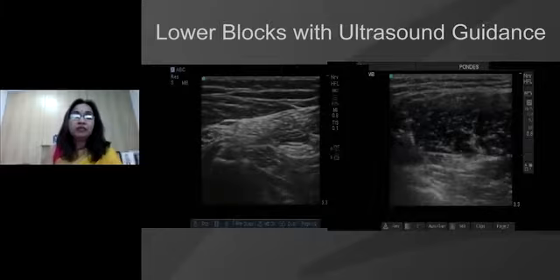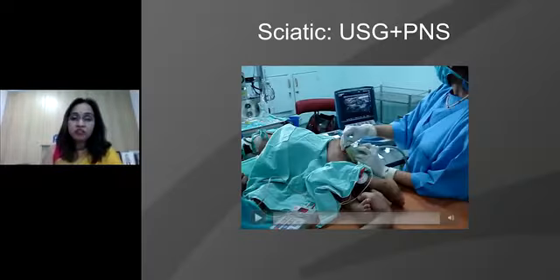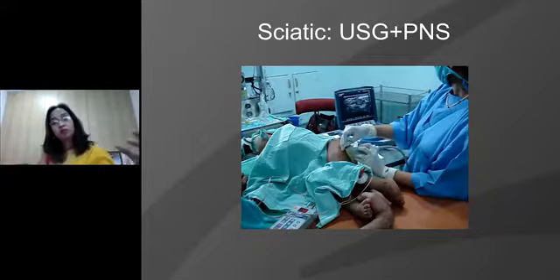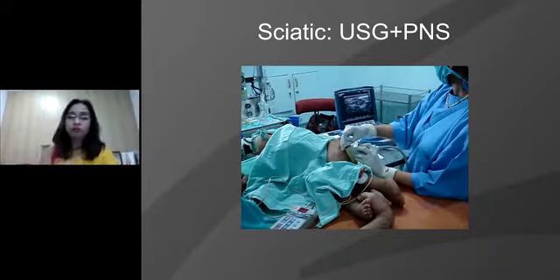So the baby is sedated. We take a transverse section as I'm showing it here, and the needle can be put in plane, under vision, or we can go out of plane as well. Here I have shown a baby in lateral, but you may as well keep the baby supine. You may as well give a lithotomy position. For kids, it's very simple. Somebody can just simply lift up the child's leg for you to work upon.